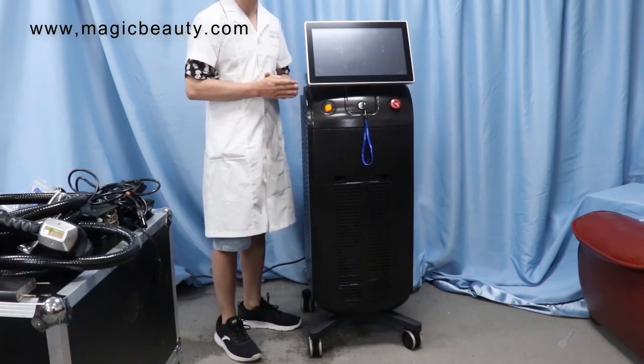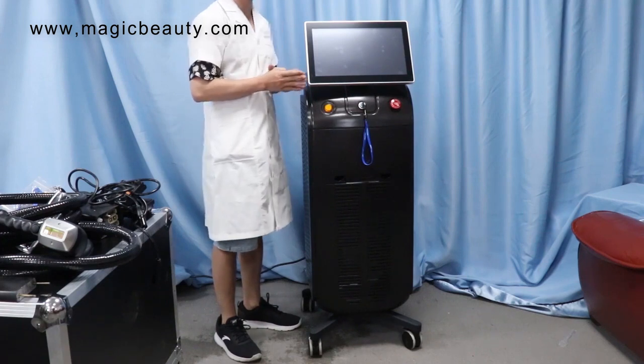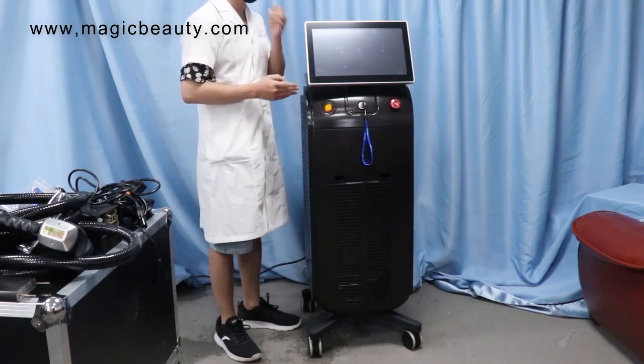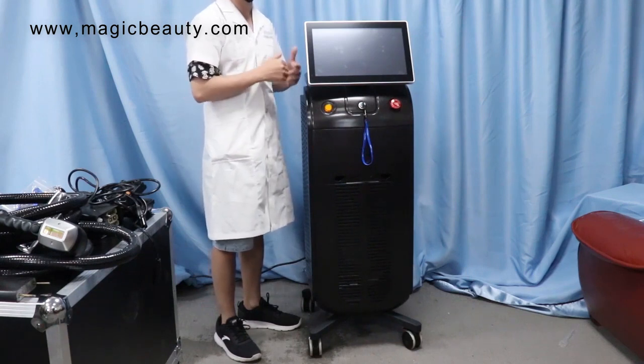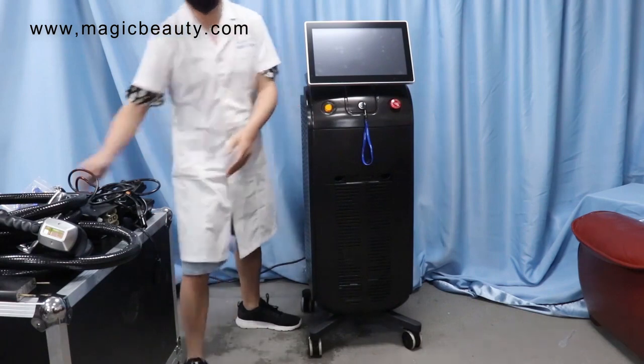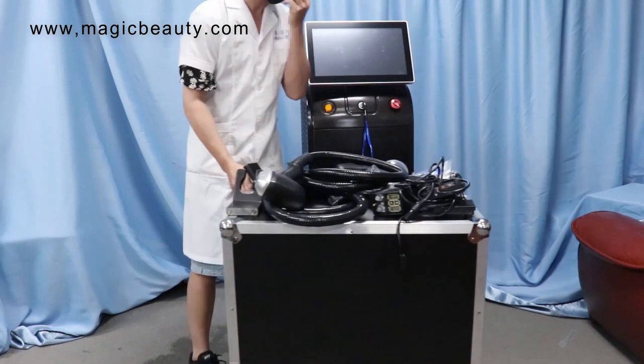For this video, I will show you guys the parts and the accessories for the machine, and how to make the installation before you do the operation, and how to add water. Firstly, we will show the parts that come together with the package.